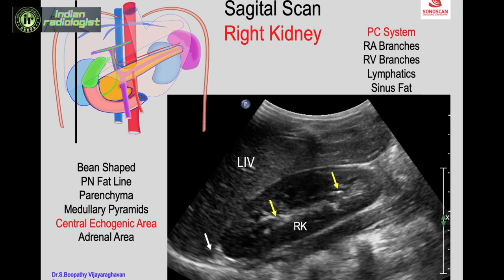Above the upper pole of the right kidney is the adrenal area. The normal adrenal is not visualized on ultrasound in adults.